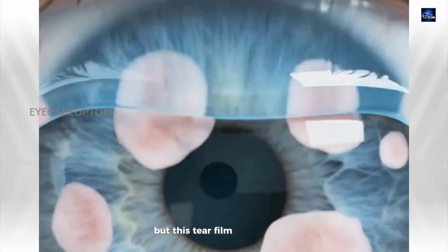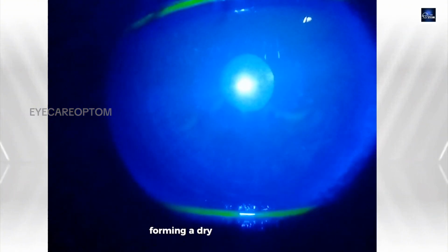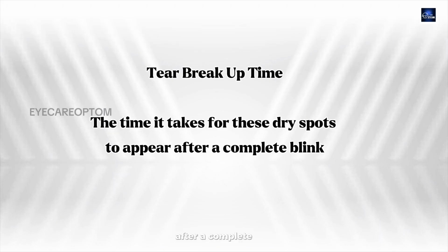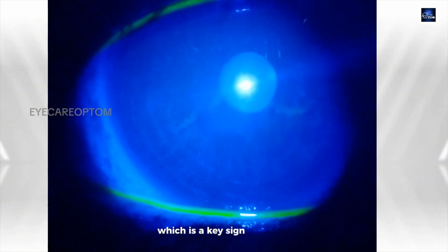But this tear film does not stay forever. Over time, it begins to thin and break up, forming a dry spot on the corneal surface. The time it takes for these dry spots to appear after a complete blink is called the tear breakup time. A short tear breakup time means the tear film is unstable, which is a key sign of dry eye disease.